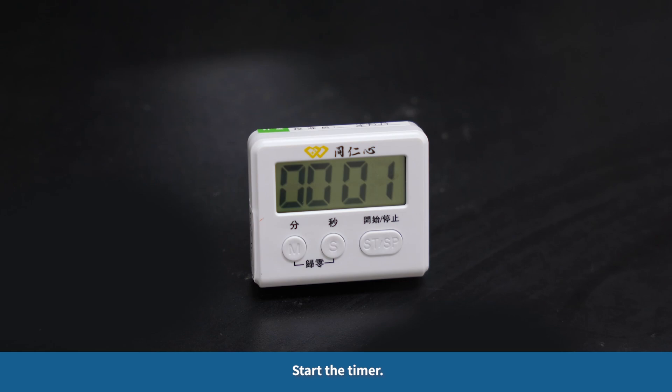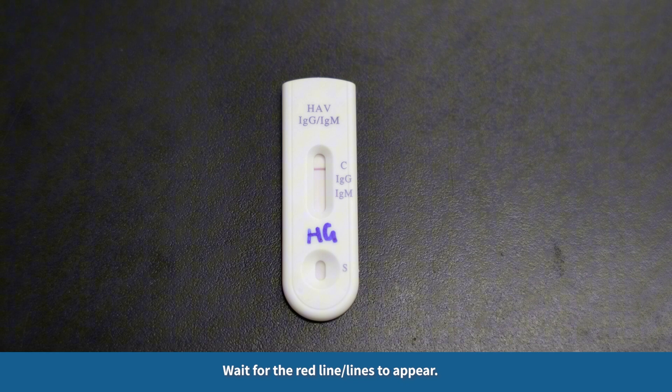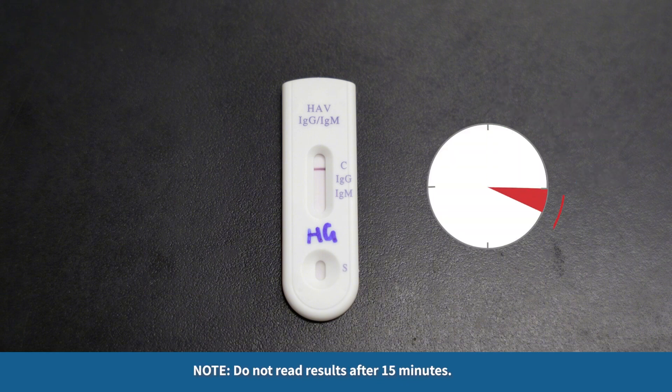Start the timer. As the test begins to work, a red color moves across the reading window of the test device. Wait for the red line or lines to appear. Read test results in 15 minutes. Do not read results after 15 minutes.